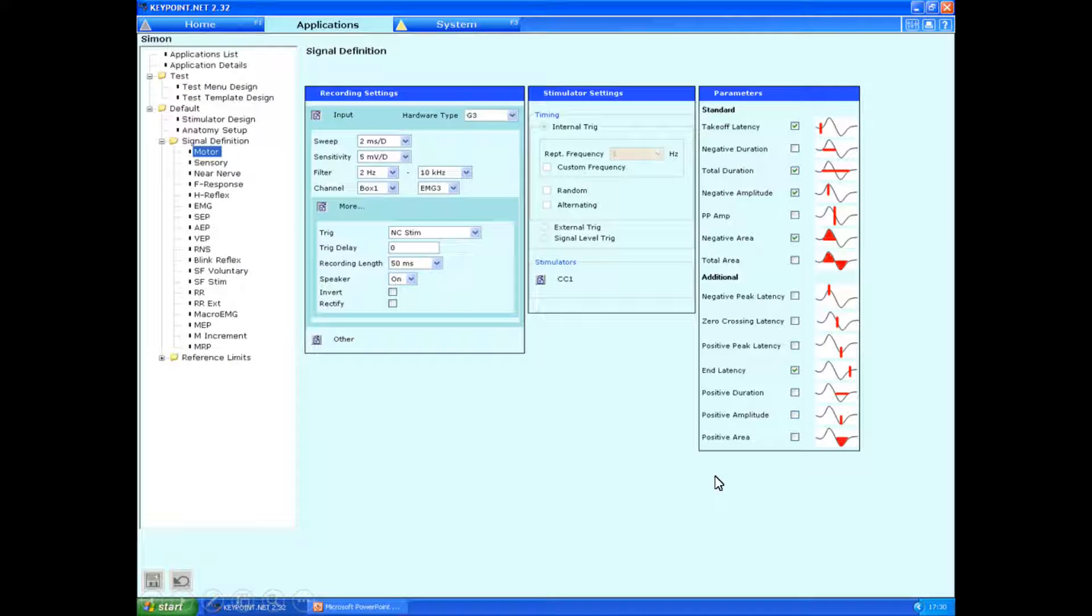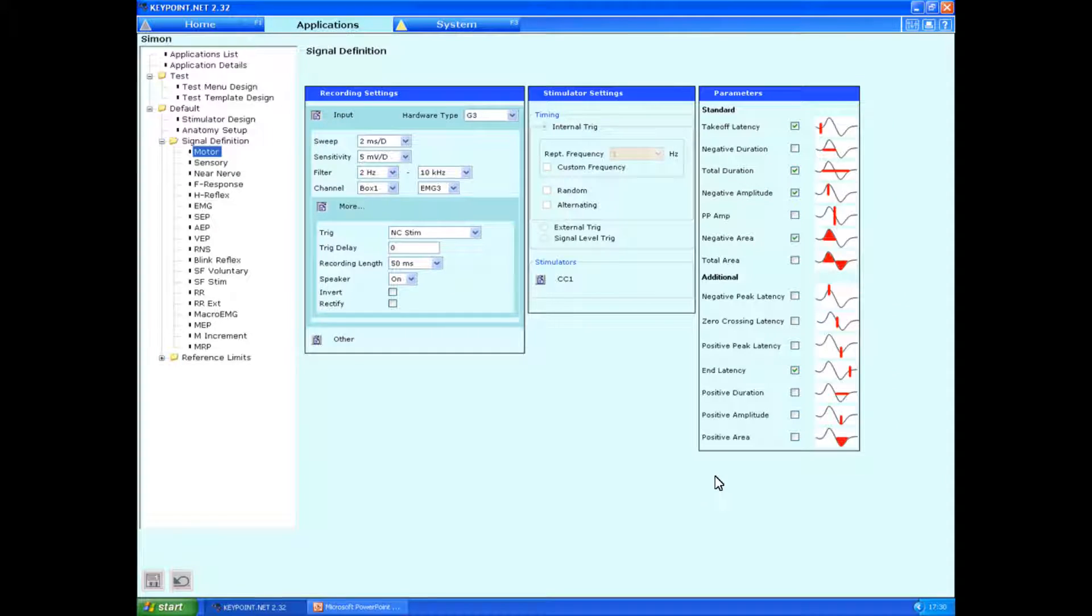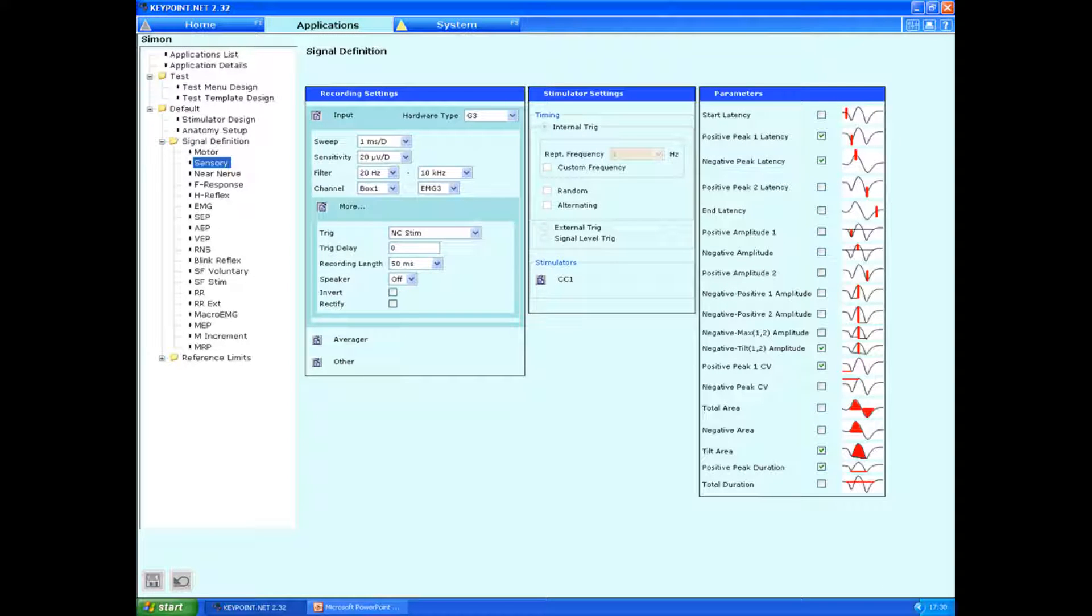I can't emphasize enough the importance of using standardized settings for the sweep sensitivity and filter when performing neurophysiological studies. I highly and strongly recommend using AANEM settings. You can see them over here. You can also tick box whichever markings you want to see displayed.